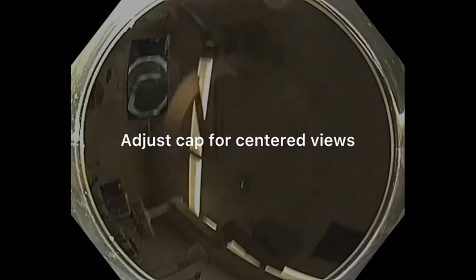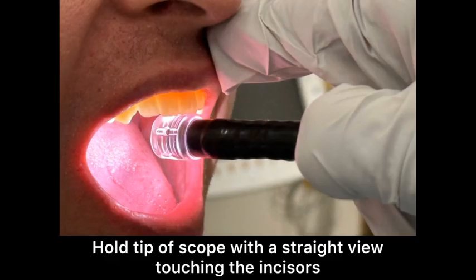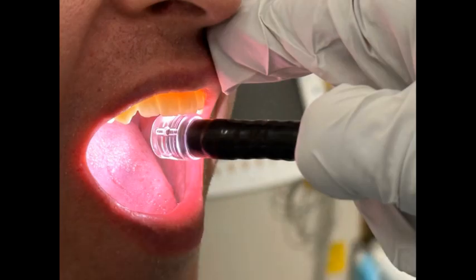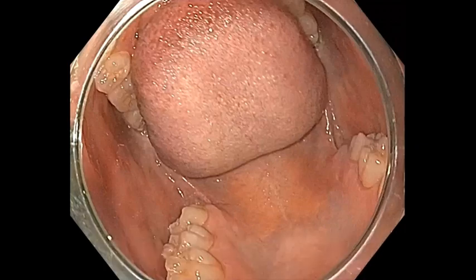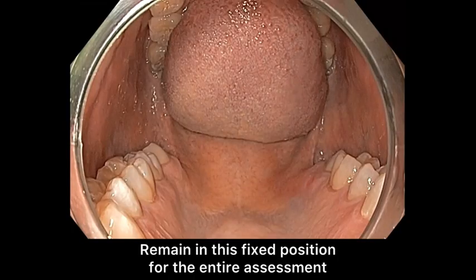Adjust the cap for centered views, with the cap only slightly protruding. Find your ideal scope position. Hold the tip of the scope with a straight view touching the patient's incisors. Rotate the scope tip to achieve centered views. Remain in this fixed position for the entire assessment.